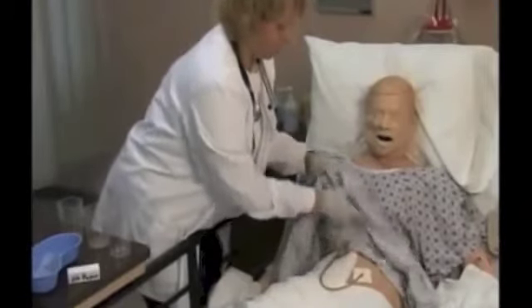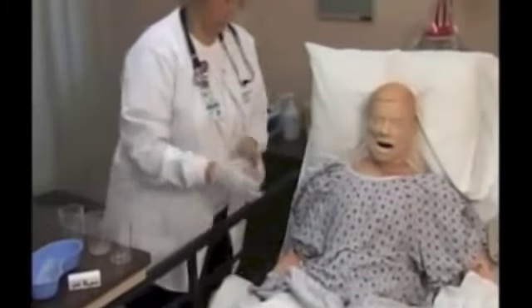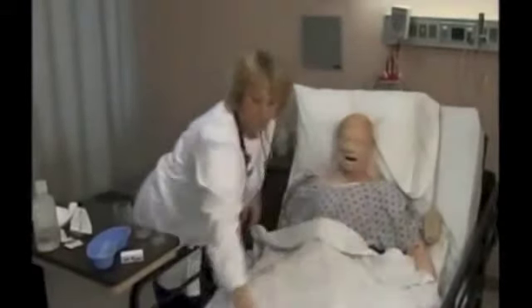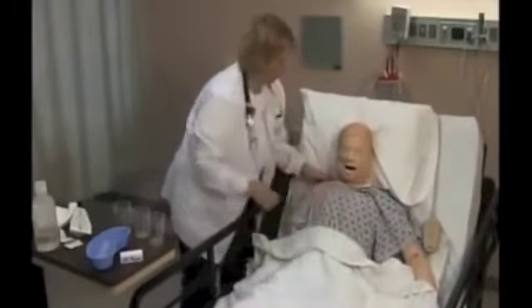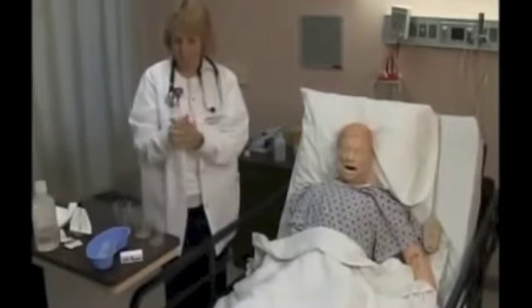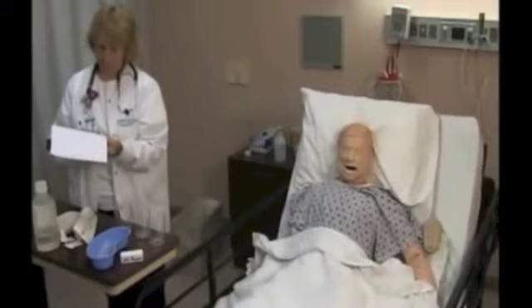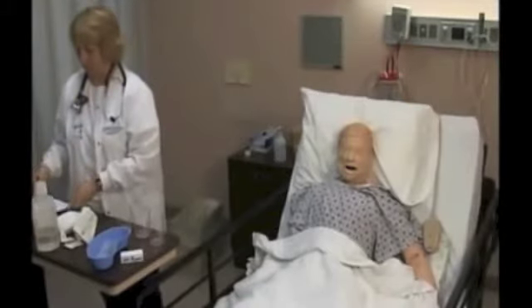Leave the head of the bed elevated after feeding. Discard your work gloves and cover the patient up. Lower the height of the bed if it was raised. Wash your hands. And document abdominal assessment, presence of bowel sounds, placement check, amount of residual, amount of flush, type of tube feeding, and any patient complaints.